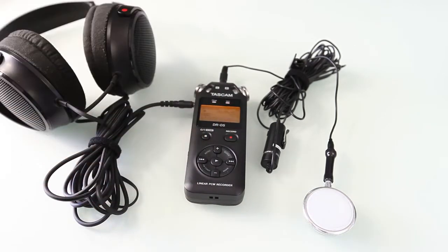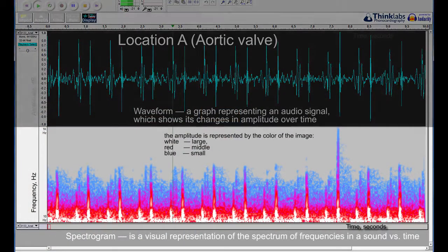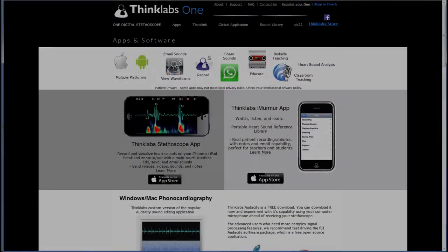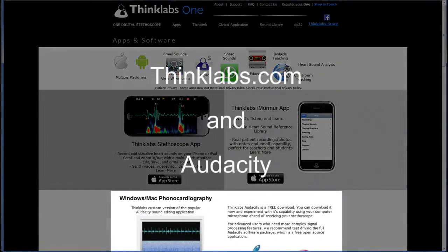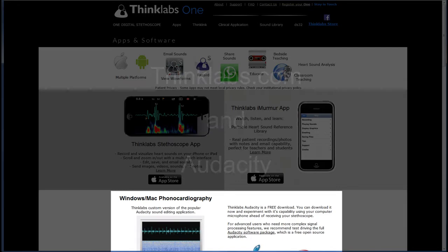Later, I will view the waveform of the recorded sound of my heart. It is also possible to view its spectrogram, that is a visual representation of the spectrum of frequencies in a sound versus time. The horizontal axis represents time, the vertical axis represents frequency, and a third dimension indicating the amplitude is represented by the color of the image. For recording and playing back, I will use ThinkLab's phonocardiography powered by Audacity software that is free and can be downloaded from thinklabs.com.